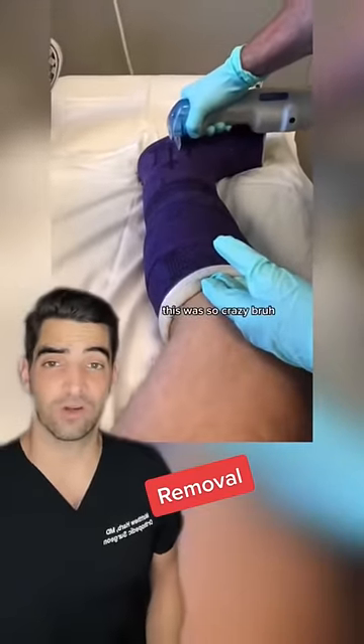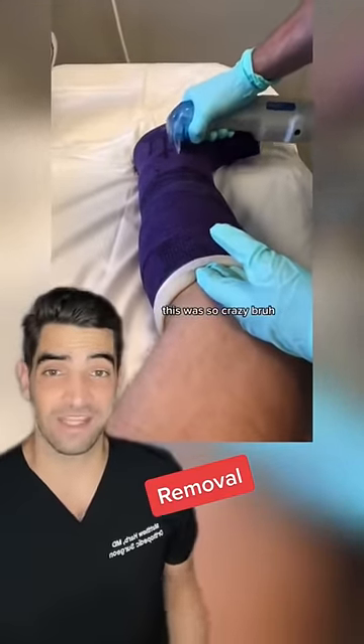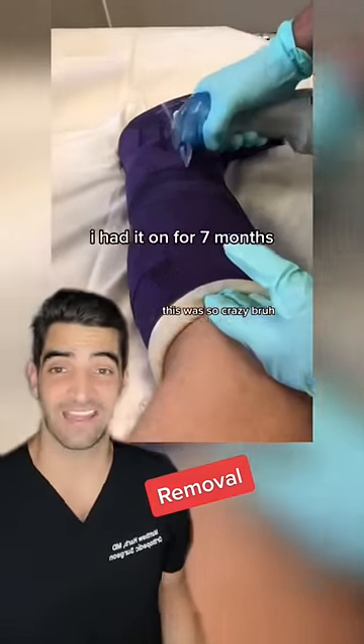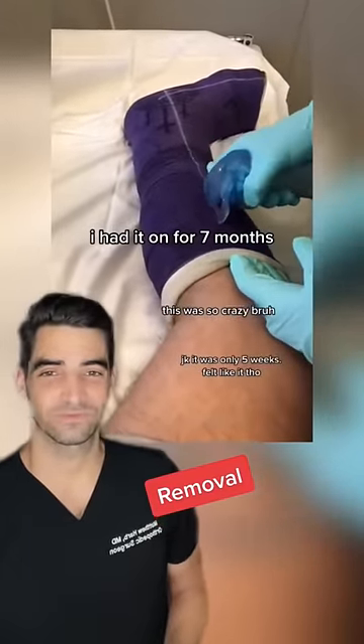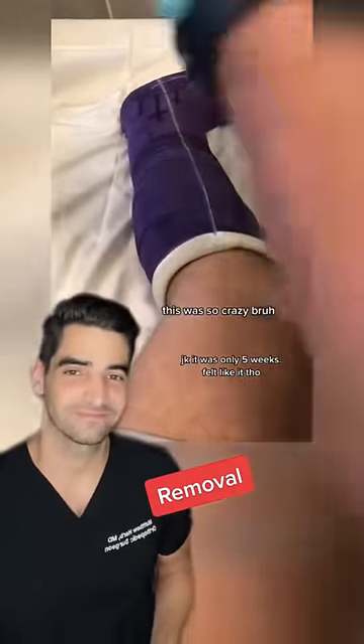He's doing a technique called a bivalve technique, where he's making cuts on both sides of the cast. I had it on for seven months — JK, it was only five weeks. Felt like it, though.